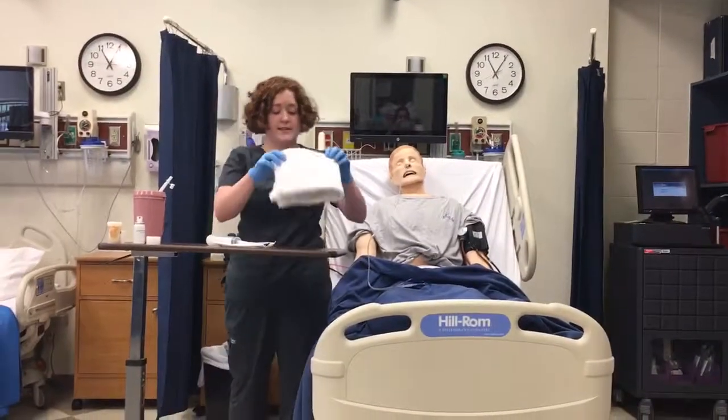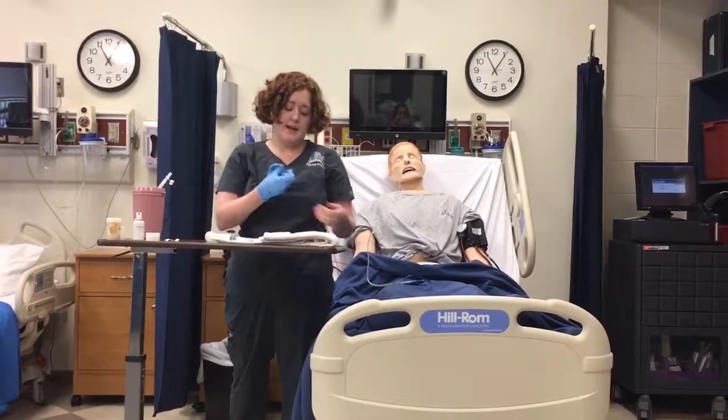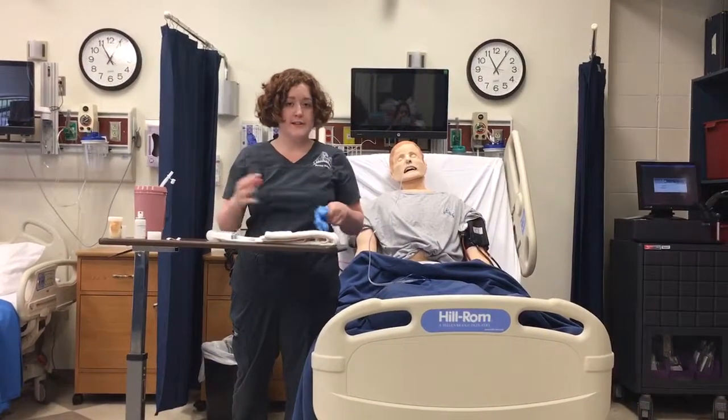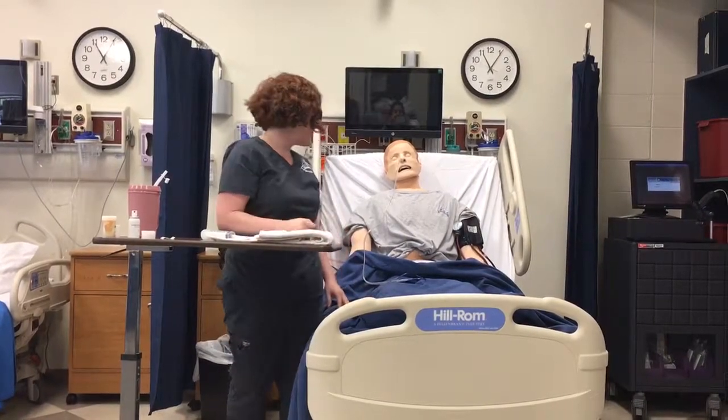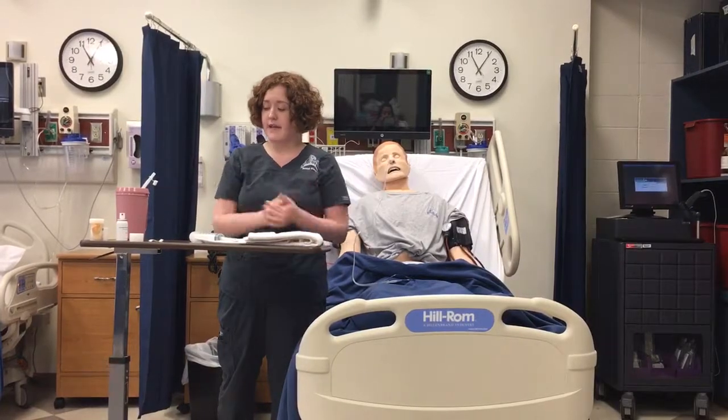I'm going to assess my patient, see how they tolerated the procedure, and I'm going to document all relevant data and make sure that my client is in a safe and comfortable position before I leave the room. And that is all.